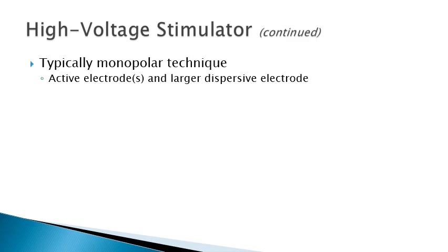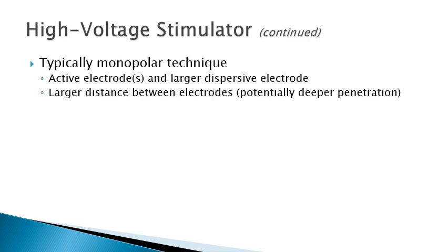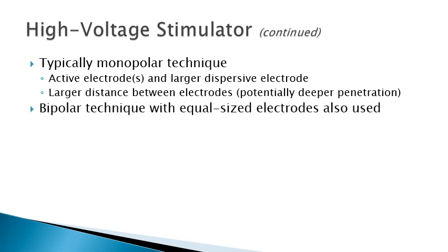Okay, so again, typically it's a monopolar technique with high volt, depending upon what it is you're doing. The idea there is you'll have a smaller active electrode to concentrate the charge in a larger dispersive. The larger the distance between the electrodes, and this would go for any type of stim, you would get deeper penetration. So even if you're just looking at any type of stim, the further you put the pads apart, the deeper it tends to go.